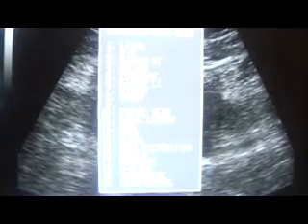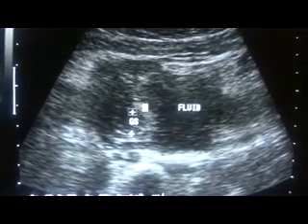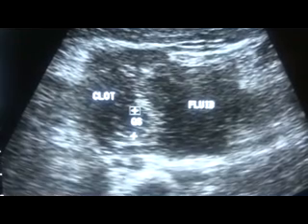In the region of the right adnexa, we see a gestational sac surrounded by a heterogeneous solid area with no shadowing. This is surrounded by fluid with echoes, which is bleed, and this echogenic area is the clot in formation. This is the liquid form of the fluid with echoes — that is bleed — and you can see it is extending.